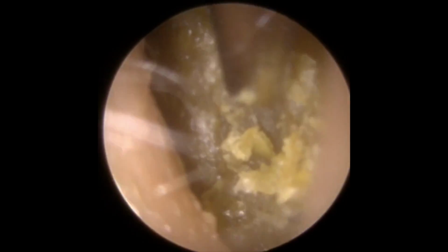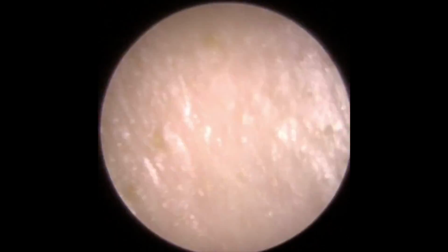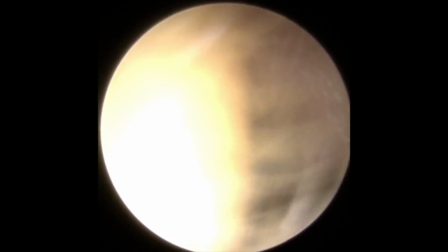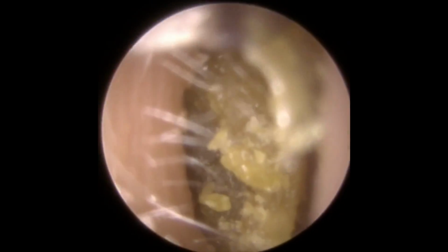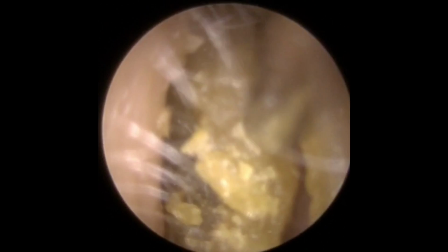Now I always say, every time we do this video, we try and avoid the canal wall as much as we can. In this case, we don't really have much of an option. We have to work close to this canal wall. So when you're doing a procedure like this, you always check in with the patient, make sure they're happy, they feel okay, they're comfortable, constantly reassuring. If they get uncomfortable, we'll take a break for a bit. But this lady just wanted this out. It was causing so many problems with her hearing, so uncomfortable in her ear, that she just wanted to get rid of it. You can see we've managed to turn it now from the right to the left.